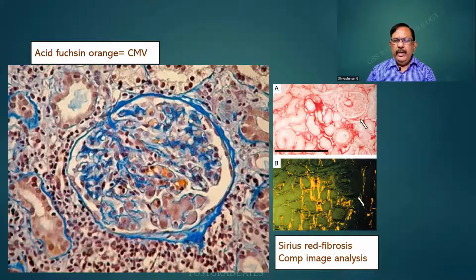And today we are in a world of telepathology where pictures can be sent all over the world. And to my knowledge, pathologists are colorblind. They know only hematoxylin and eosin. Look at the play of colors over here. I hope you can identify the stain.